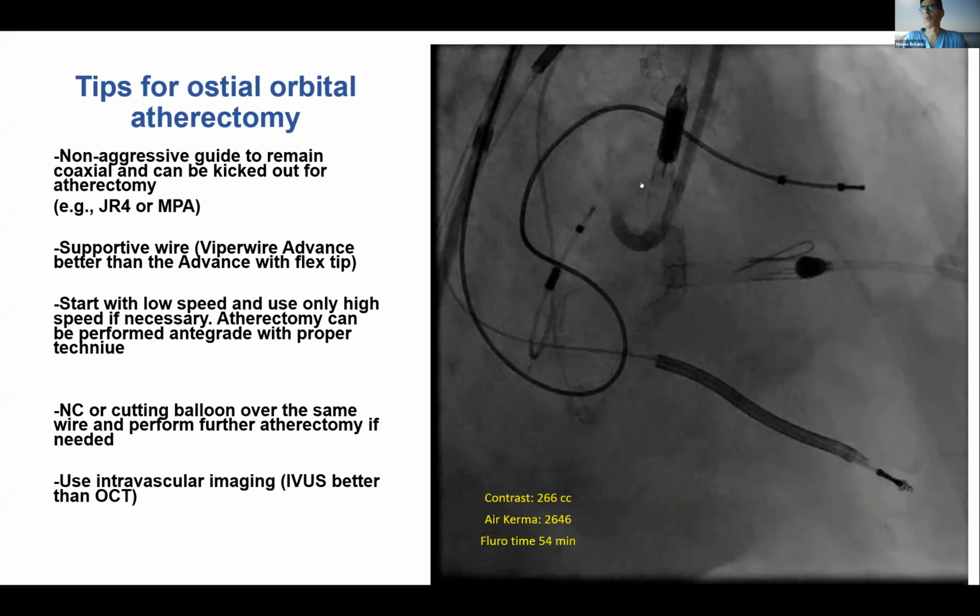Another intriguing proposition that Stefan Harp just proposed actually is to do intravascular lithotripsy if you have a bifurcation in the main vessel. And that sometimes can actually modify enough the side branch to facilitate other equipment for going through. So you do have quite a few options. In terms of microcatheters, you can also use something like the Tornus or the Turnpike Gold that are plaque modification microcatheters and might modify the lesion enough to allow subsequent equipment to go through.